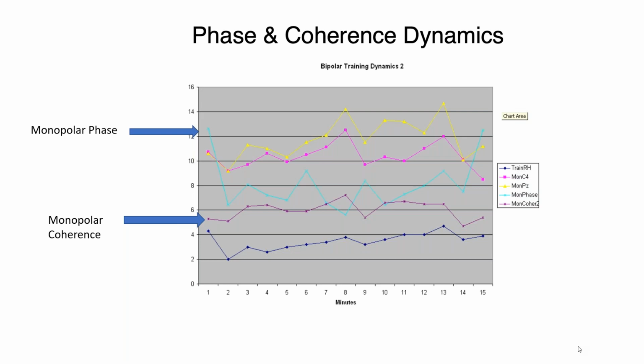And I heard what you said the other day, and that made sense as well, that you think alpha theta can do as well as bipolar, for trauma, yes. Which is really the only time I'm using bipolar, is with some kind of a trauma-based problem. They're really different tools, and we haven't researched the difference between those two methods, but they're both calming. They both get you into a really calm zone.